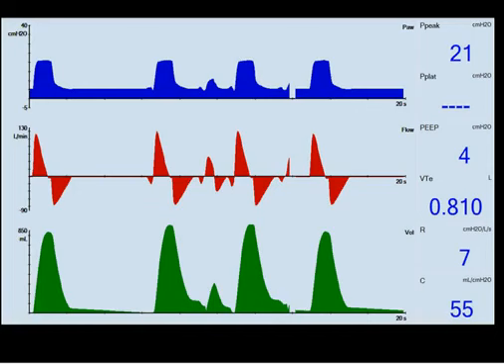So this picture shows our ventilator waveforms, and if we look at our pressure waveform, we see a couple things. We see our fixed mandatory breaths for a fixed pressure for a fixed amount of time. If we look at our flow waveform, we see the flow distortions going on, and you can also see in the pressure waveform, these are my spontaneous breaths in between my mandatory breaths. However, my spontaneous breaths are not for a fixed amount of time. They look totally different from my mandatory breaths.